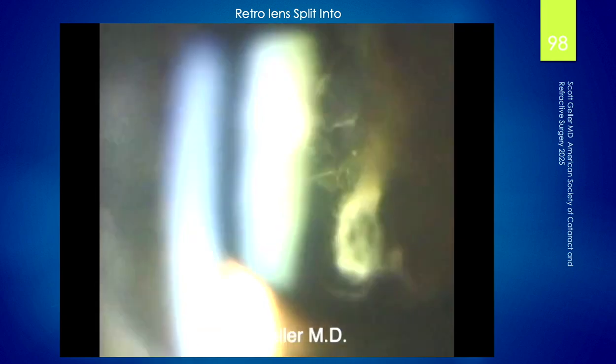There we go. That is what you see, these giant masses, very, very disturbing to a patient, extremely disturbing to one-eyed patients. You've got to go very slowly. Excessive laser in this particular area of the eye, even if you can get the opacity, can cause elevated pressure. Let's go on here. This was tough. This was a tough one.